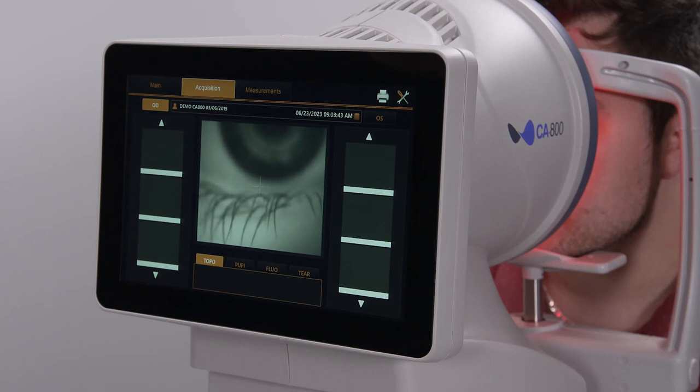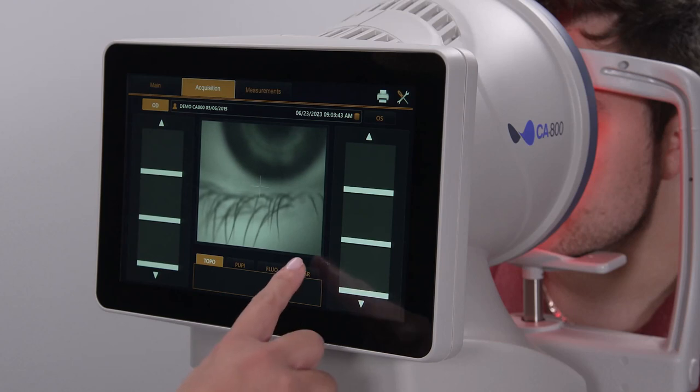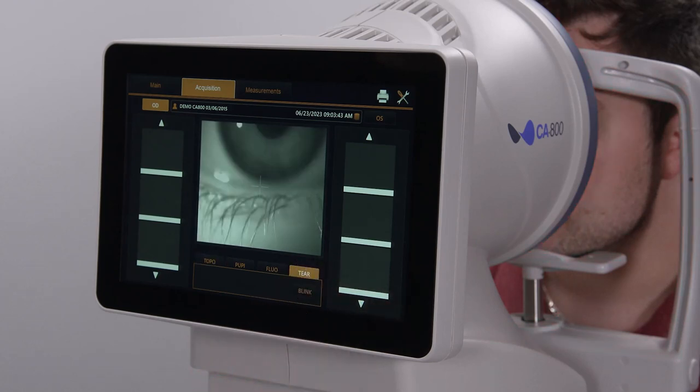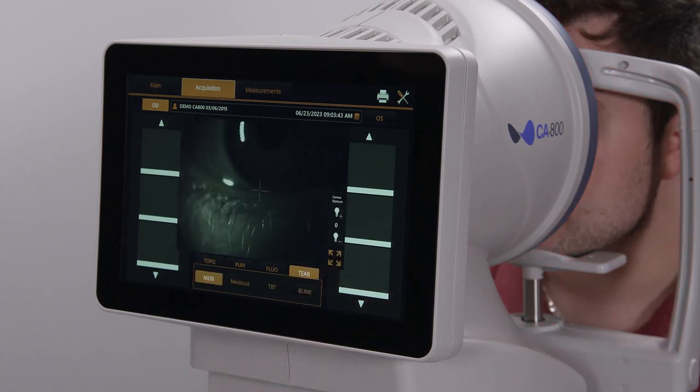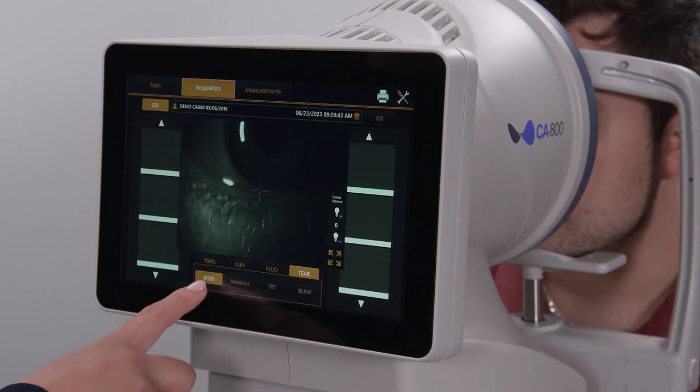To start taking images, simply select the tier tab at the bottom of the screen, then select the MIB option.